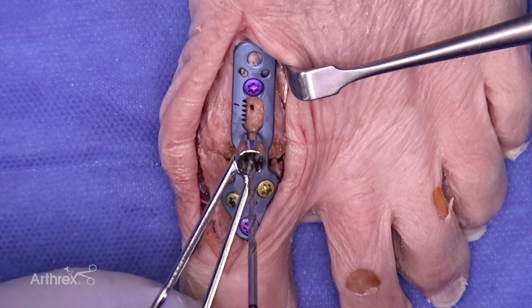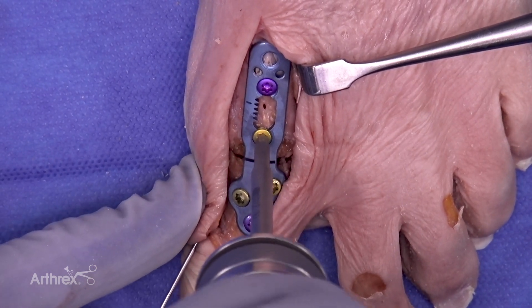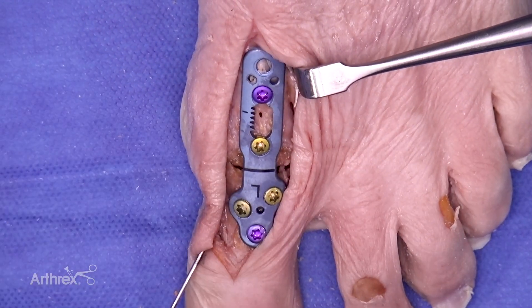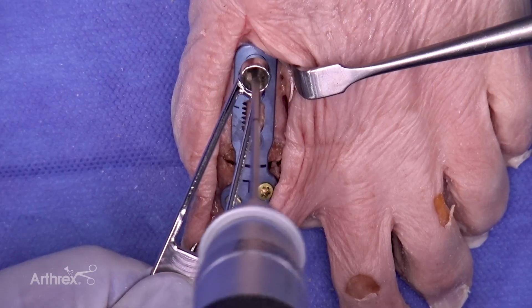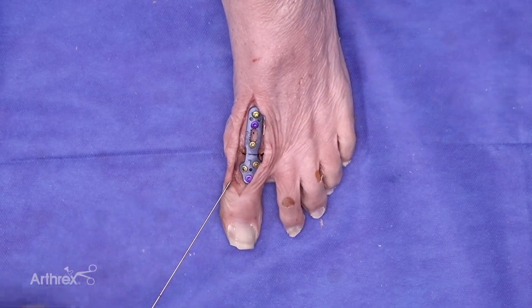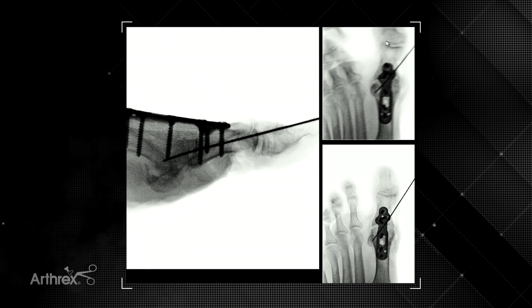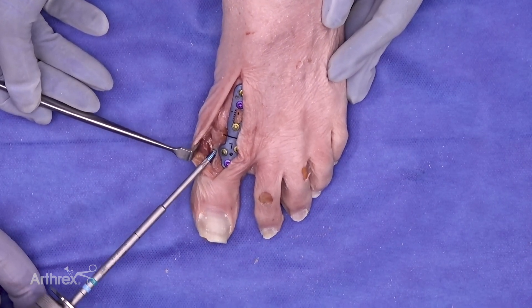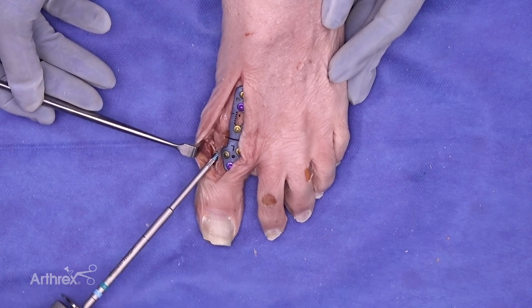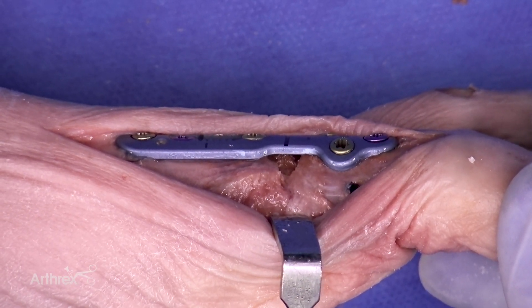An important part of the technique is to place a locking screw in the distal hole of the metatarsal to increase strength of the construct. We'll place the final locking screw proximal in the metatarsal. The screw construct allows for easy positioning of the Interfrag screw in the inferior portion of the joint. To finalize compression, seen here is placement of the 3.5 mm FT compression screw. Notice the absence of any prominent hardware, avoiding symptomatic hardware post-operatively.